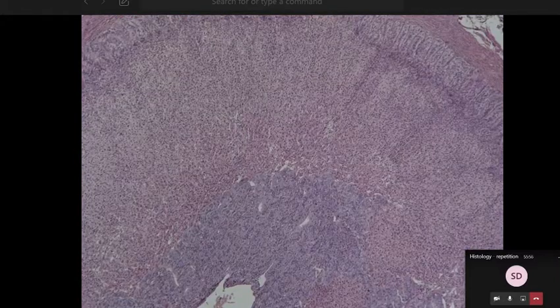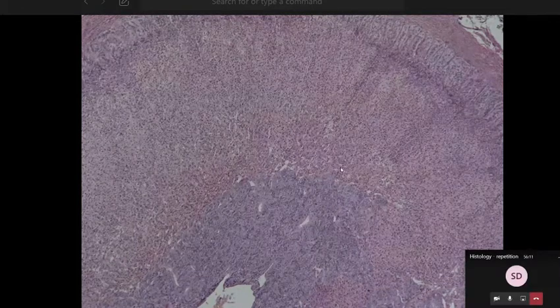And over here we have another endocrine organ. This is the adrenal gland, which is covered by a connective tissue capsule. Here we have a well developed connective tissue capsule. Histologically, we can divide this organ into the cortex, from the connective tissue capsule to this place, and here we have the medulla.